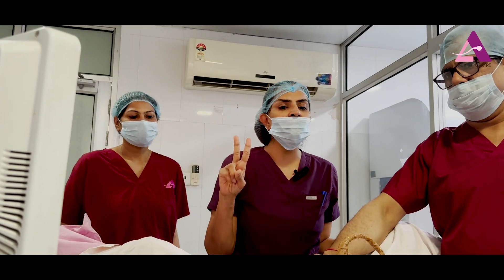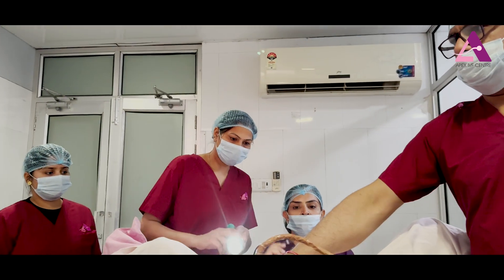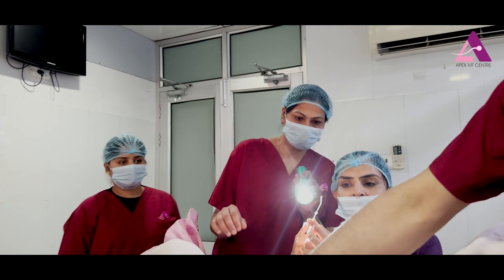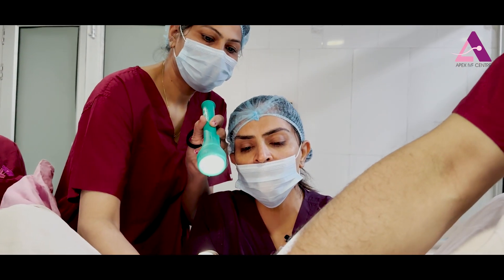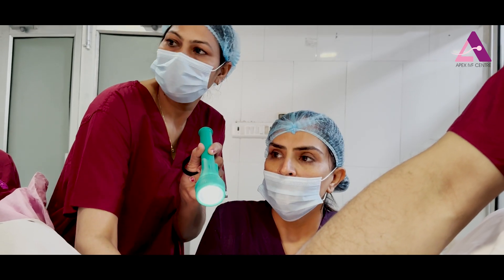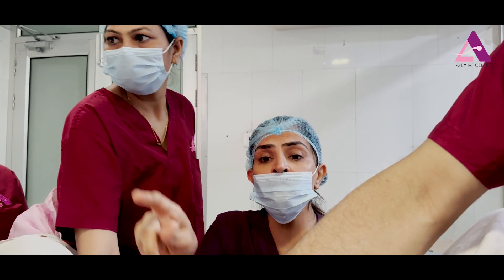The patient is informed that we are putting two blastocysts, and she is okay with it. Now this is the outer catheter — it's a very fine plastic tube. There is no sedation given to the patient.